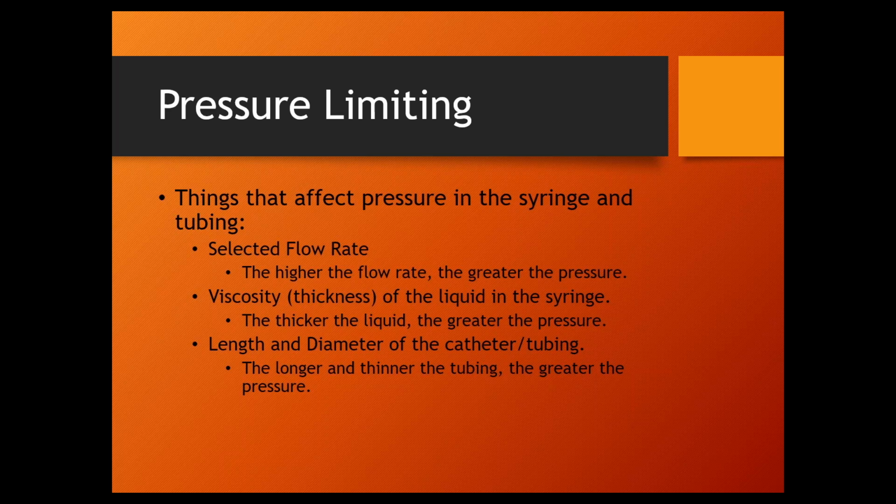They forgot to fill the other syringe up, and there is no indicator. The machine does not check if there's actually fluid in the syringe. The operator has to hit a button saying I have checked for air. And they did it, and then bang, they just fire an empty syringe into a patient. It's very rare, but it does happen. So that's why I'm like, let's make it pink or green or something that I can see from a distance, like, oh, that syringe is empty.